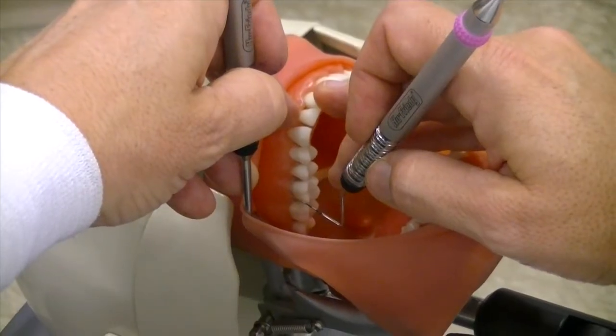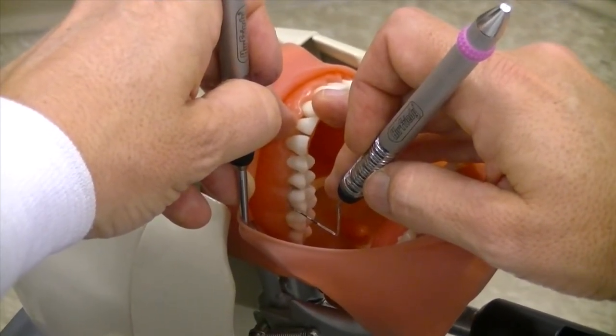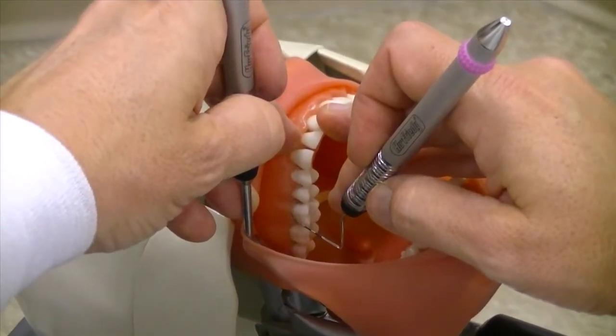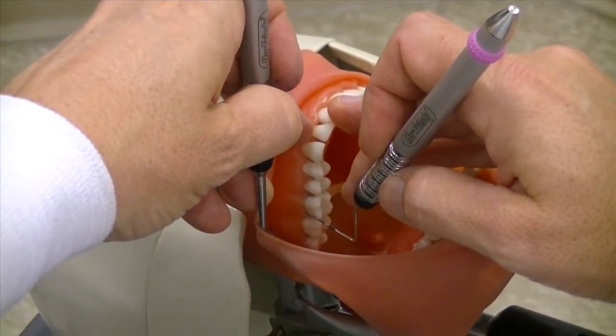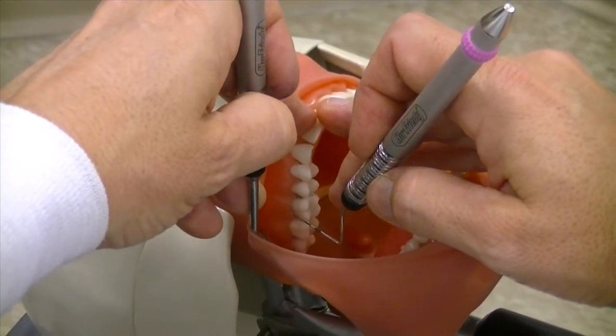Probing the maxillary buccal of the first quadrant, you're sitting at 8 o'clock, 8 to 8:30. Again, same maxillary positions as before — the maxillary first quadrant is head straight.